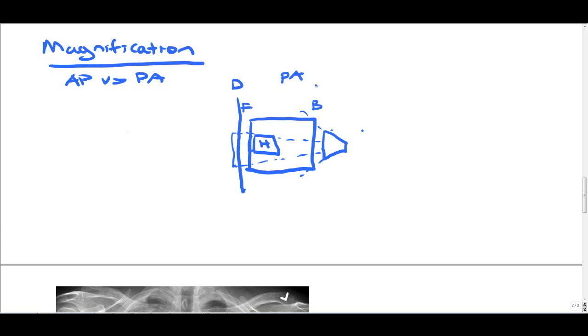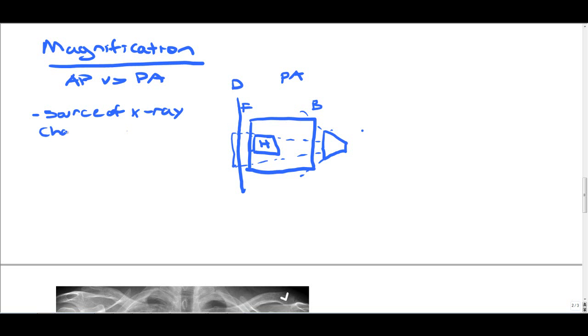That's really important to know when you're comparing x-rays, that they should be from both either all AP or all PA. And if they're not, you need to take that into consideration when you are trying to diagnose a patient based on two different x-rays. So understanding the source of an x-ray is really important in determining the way certain organs will appear on that x-ray.